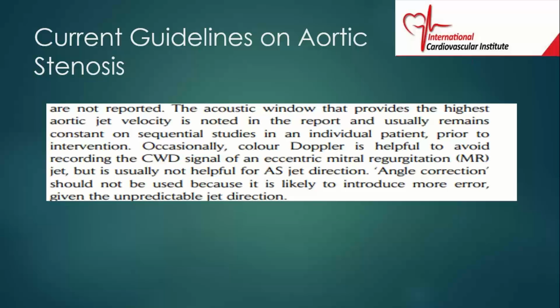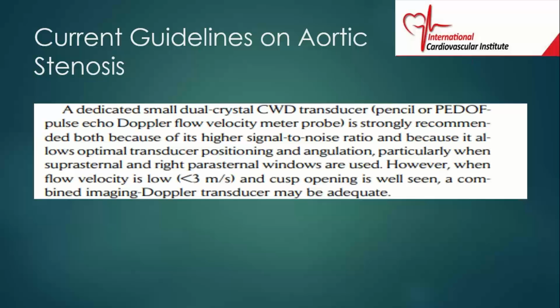So when you look at your aortic envelope, you expect to get the ejection across the aortic valve, and you should get the IVRT. That's not the situation with mitral regurgitation. With mitral regurgitation, you're not going to get that IVRT. So that's one of the things you can use to distinguish between your aortic valve envelope and the mitral regurgitant envelope. But the MR velocity is usually 5 meters per second or greater. Okay, so don't mix them up.